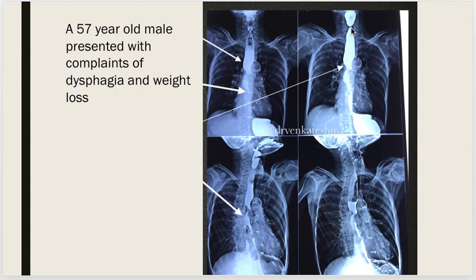This narrowing is nothing but cricopharyngeal spasm. The next finding is irregular mucosa involving the mid one third of the esophagus, which is clearly depicted here. Most importantly, you can see a smooth curved filling defect on either side — this is called the shouldering effect, due to a lesion within the lumen of the esophagus.